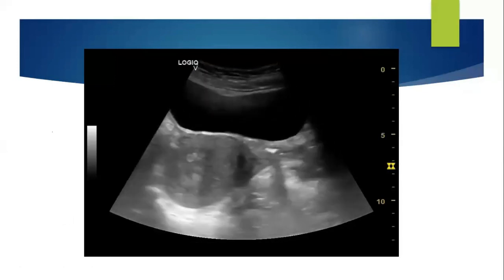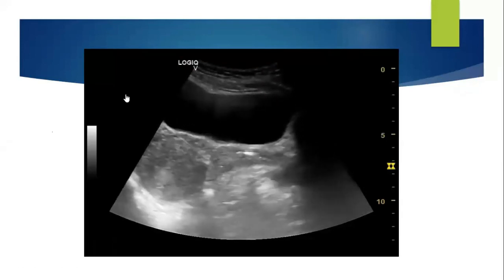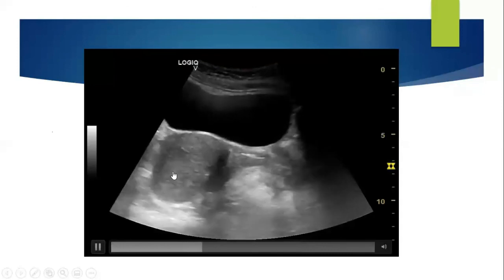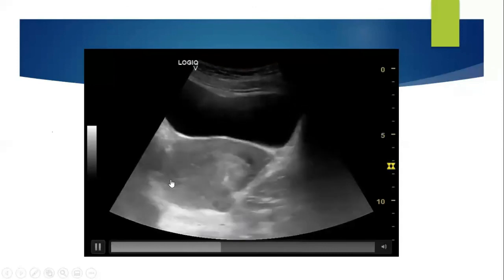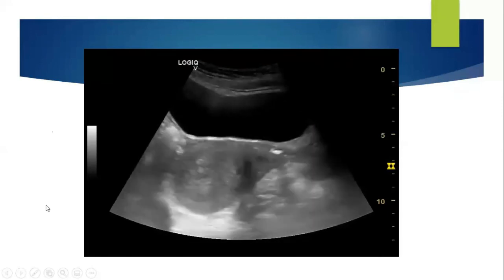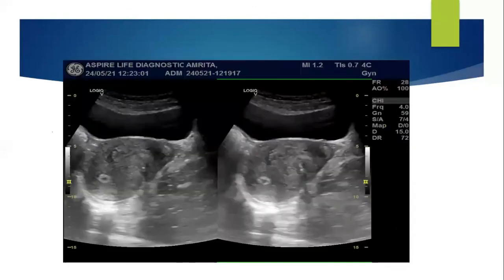Again, see this picture. Can you all see an IUCD, shadow, and an early pregnancy here? IUCD with a shadow and an early pregnancy here in the retroflexed uterus. Beautiful picture, a video, a very nice picture where we all can see this.